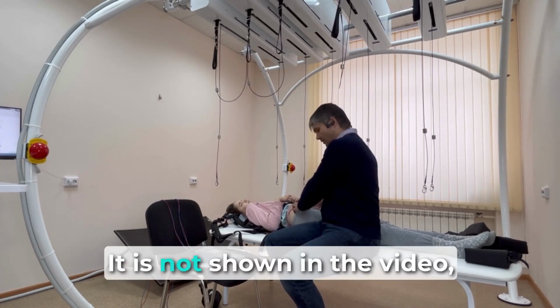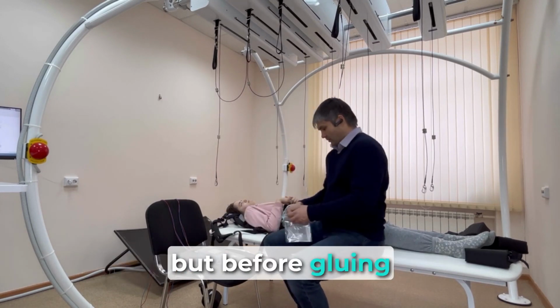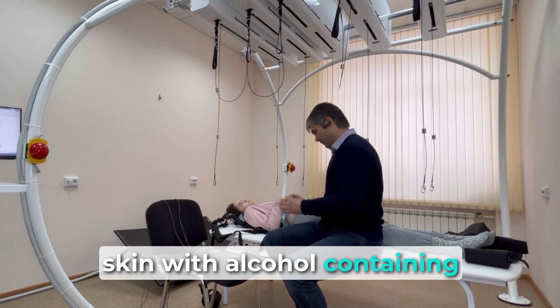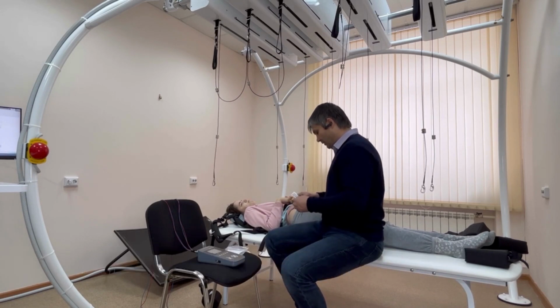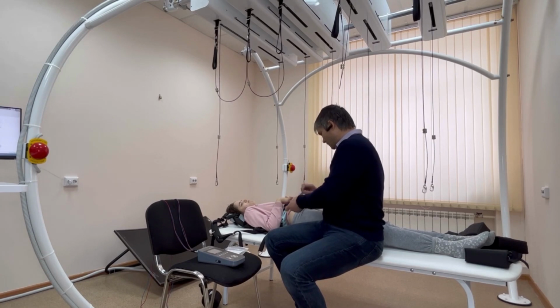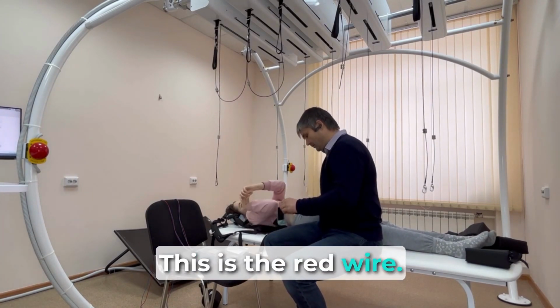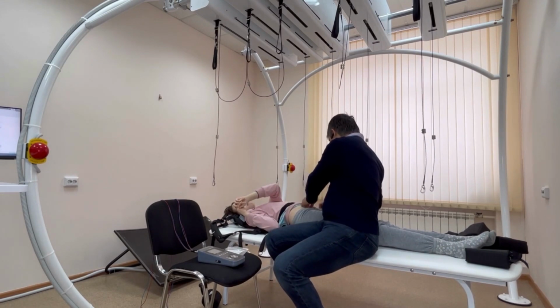It is not shown in the video, but before gluing the electrodes, it is necessary to degrease the skin with an alcohol-containing solution. Passive electrodes: this is the red wire.